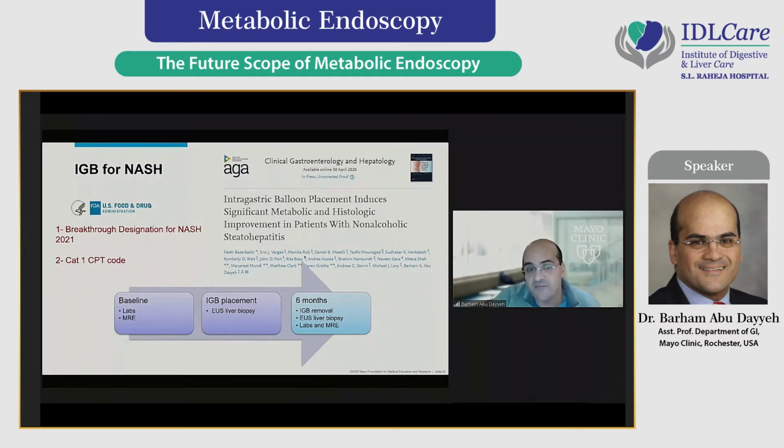And this is a recent development that, based on work we've done with the intragastric balloon and the metabolic and histological improvement in patients with non-alcoholic fatty liver disease, the FDA issued a breakthrough designation of the balloon for the treatment of NASH. And the collective work from the global community and the US trials led to a Category 1 CPT code in the United States, paving the way for reliable reimbursement for these devices, which is a milestone to celebrate collectively as a field, because we know that there are a lot of technologies that have been there for 20 years without having this pathway to market.